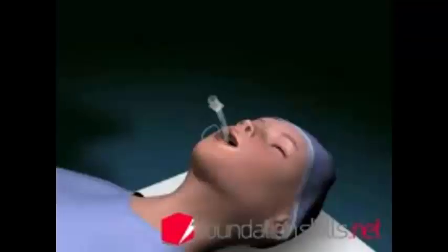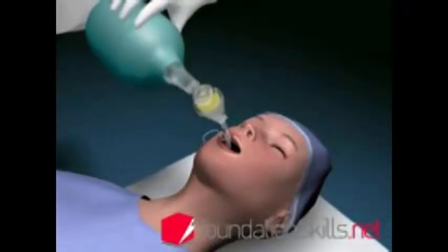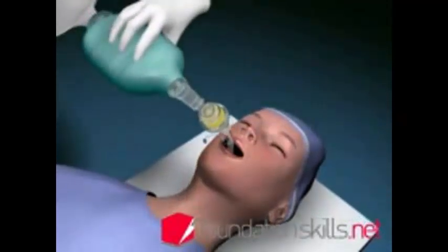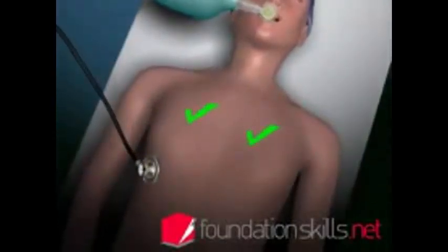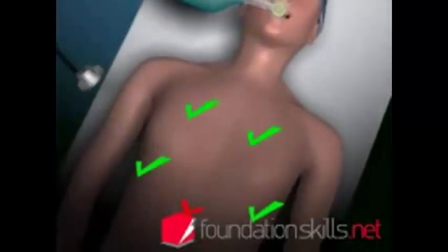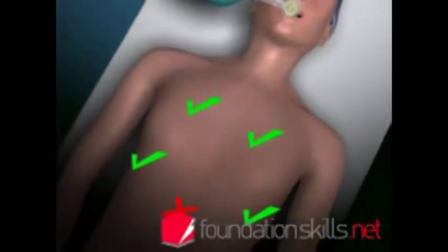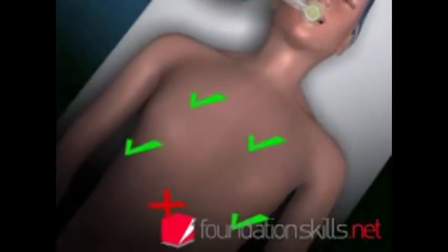Attach the tube to the bag and valve apparatus and ventilate the patient with oxygen flow at 12 to 15 liters per minute. Confirm the position of the tube by auscultating over the apices of the lungs, the axillae, and the stomach. If not in correct position, deflate the cuff, remove the tube, resort to bag and mask ventilation, and repeat the intubation process from the beginning.